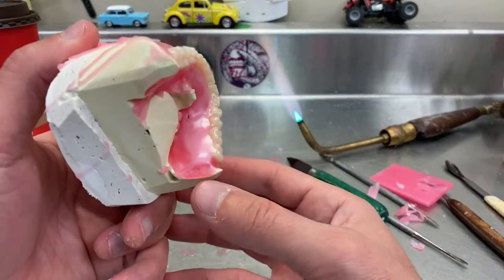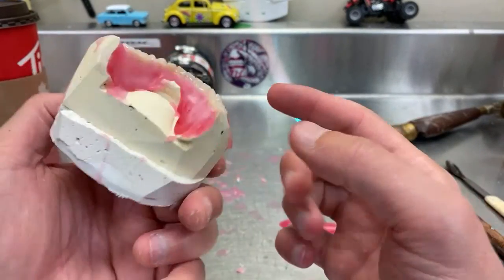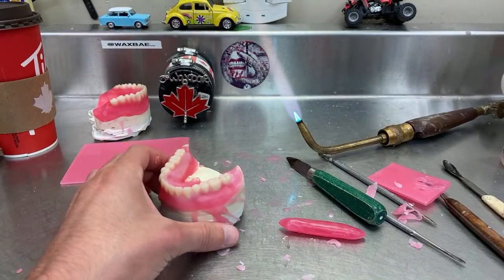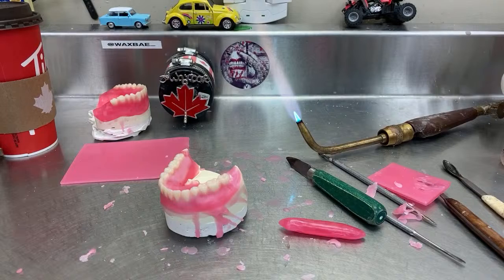See here, the wax is hot, and I can't tell if it's actually going to be covered or not, so I'm going to wait for it to cool down a little bit and then work on the upper. But I'll get the water and put it in there.